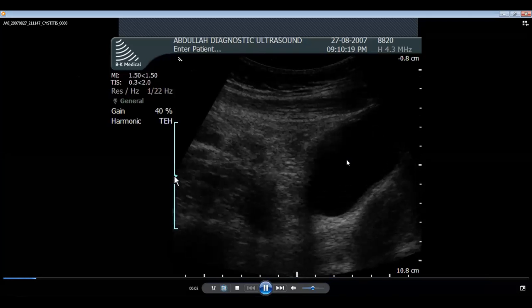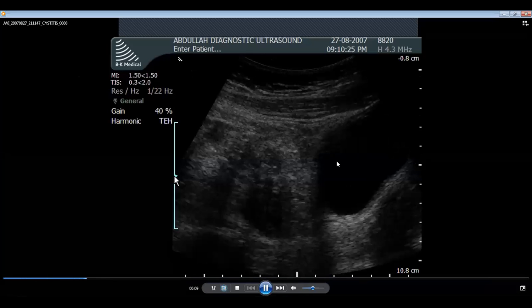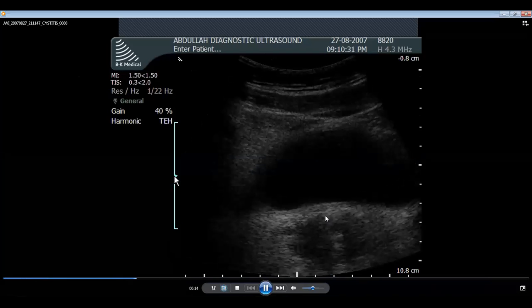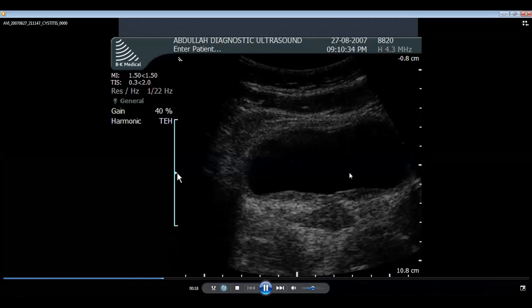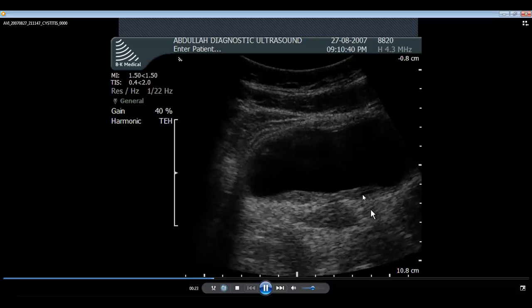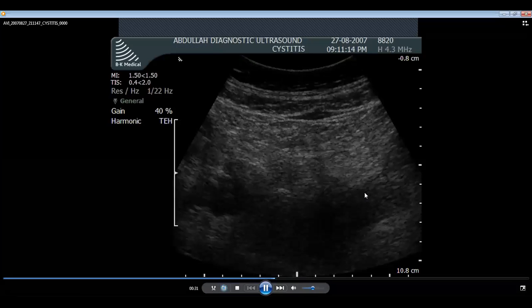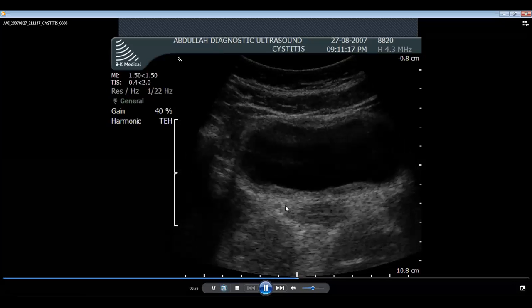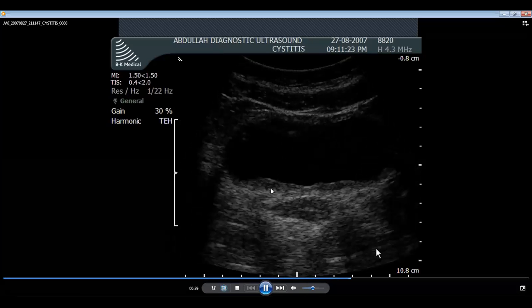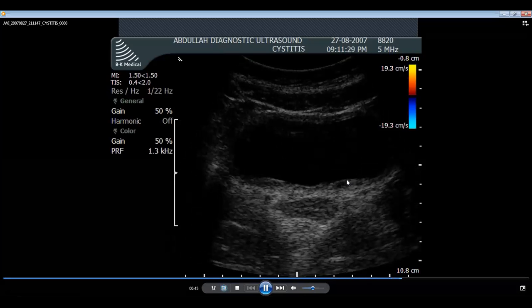Urinary bladder can be seen here in a female patient. As we can see, the vaginal lumen and the uterus and cervix. There you see the bladder. Look at the posterior bladder wall. It is elevated, the right and the left ureteric ends. So the bladder wall here is edematous and elevated because of an inflamed trigonal area, trigone of the urinary bladder, this one. So this is inflammation of the trigone area.